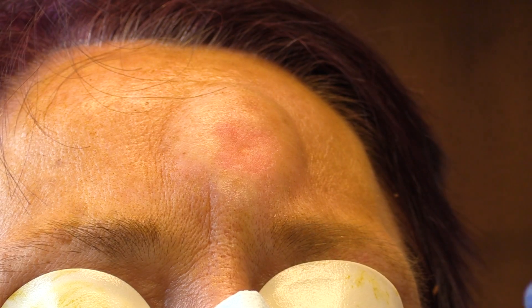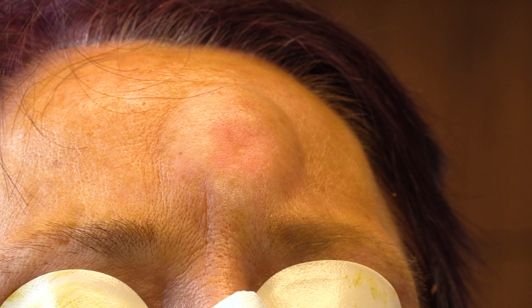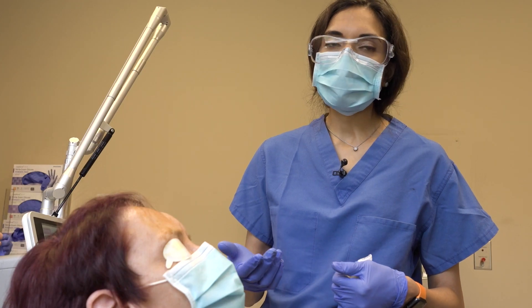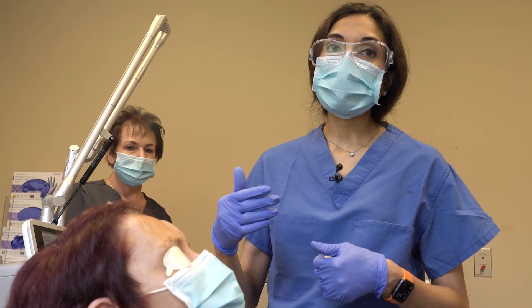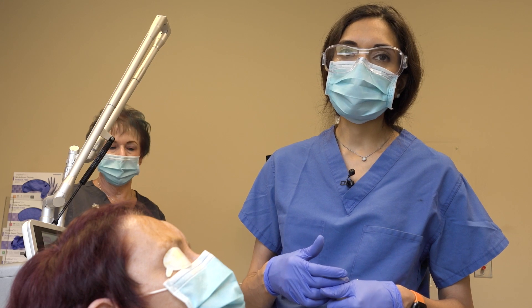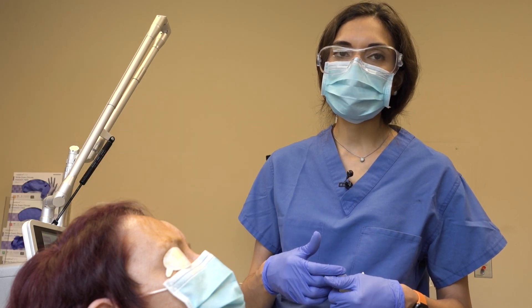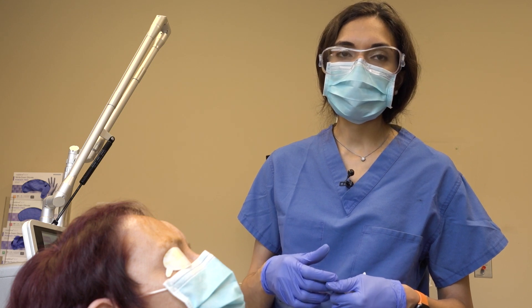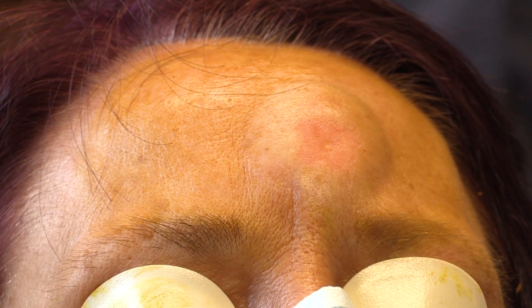If you look closely at the skin, you can see that the top layer has been smoothed, and the deeper effects of the laser will take several months to show. We usually bring people back about two weeks to check how the wound is healing, and then in about two months to see if we need more than one treatment. The effects of the laser really take two to three months, because that is how long it takes for the body to create collagen. The next step is to clean and bandage the area.